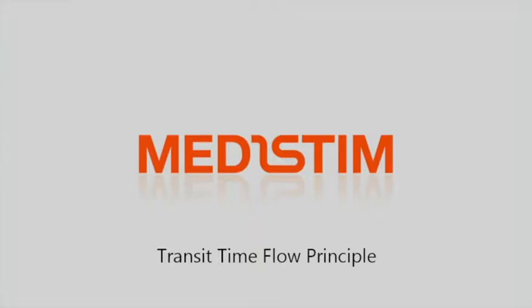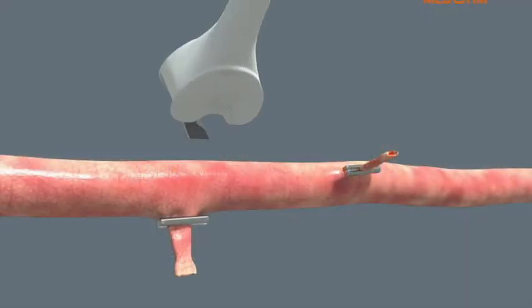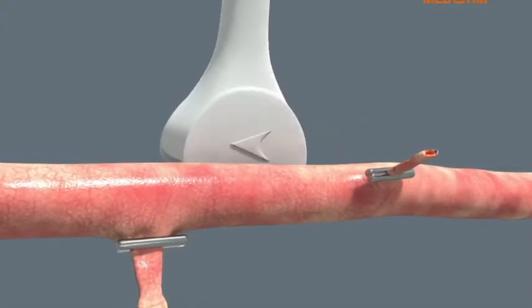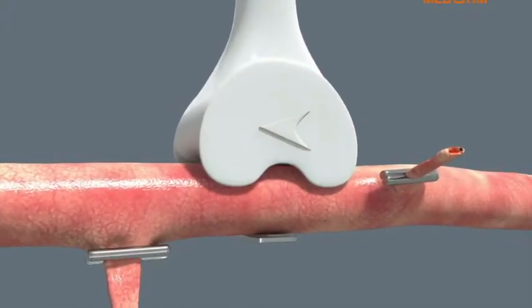Transit Time Flow Measurements works by calculating the difference in transit time for two ultrasound pulses traveling in opposite directions through the bloodstream. The probe wraps around the vessel and ensures that the measurement geometry is known.